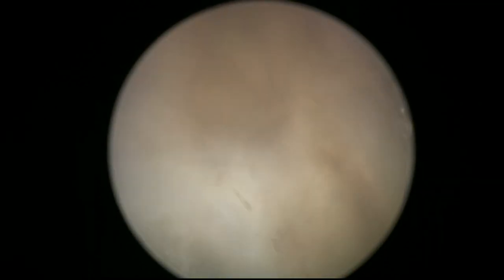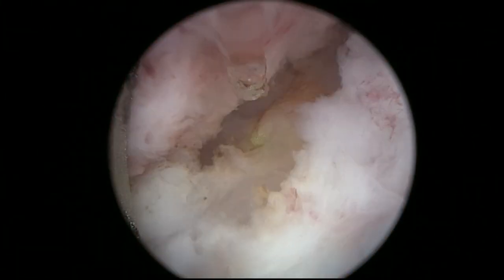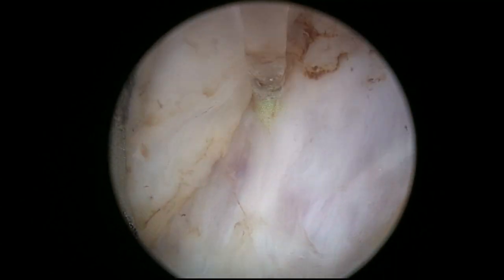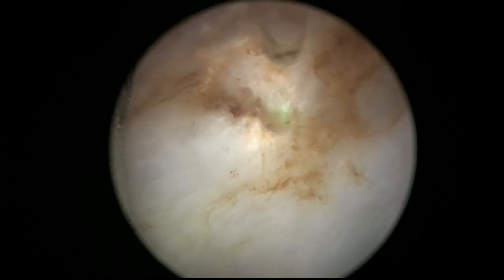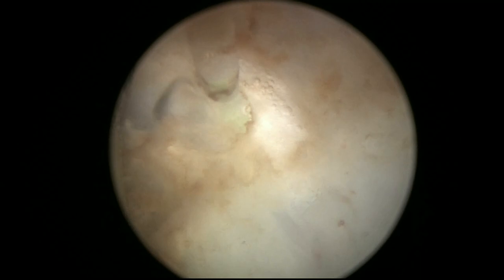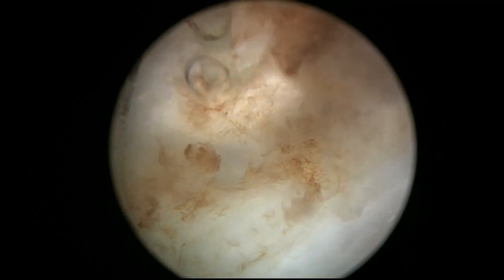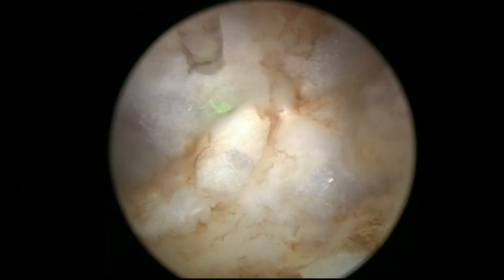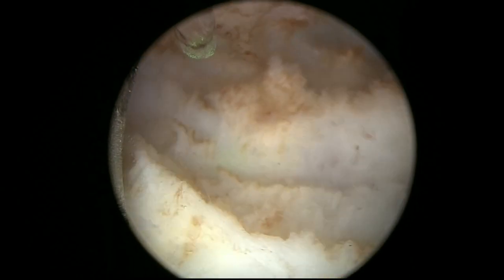Here I'm trying to navigate the posterior plane again. Mobilization is very important — all the anterior part is mobilized. Now the adenoma is hanging from a pedicle at six o'clock, so I'm trying to access and liberate, trying to gain a little mobility. Sometimes accessing here is a little bit difficult, but if you gain a little bit of exposure and mobilization by cutting around minimally, you get much better access and then you can move forward. You have to be patient, try to approach this area from all sides, gaining millimeters on each side, and then you can perfectly reach there, and the case will be yours.